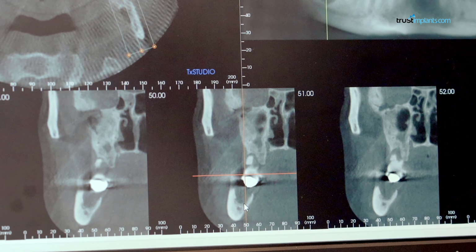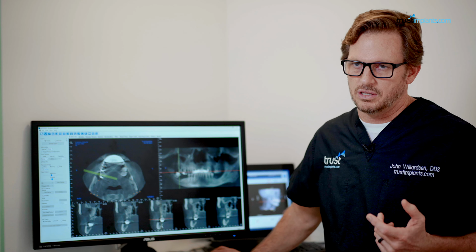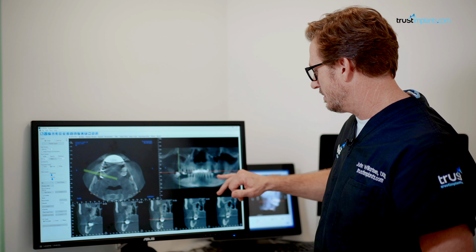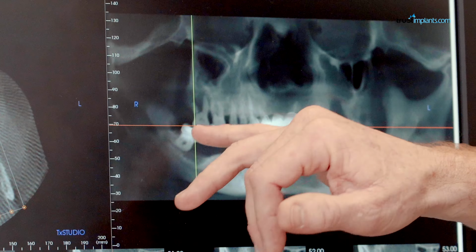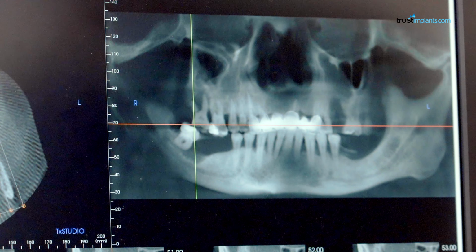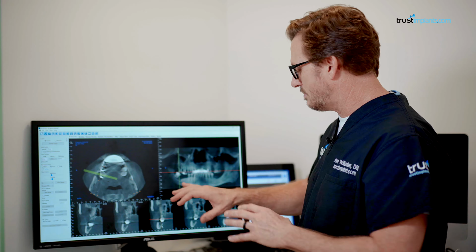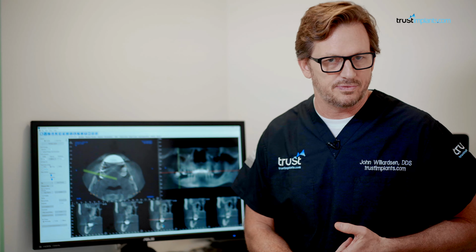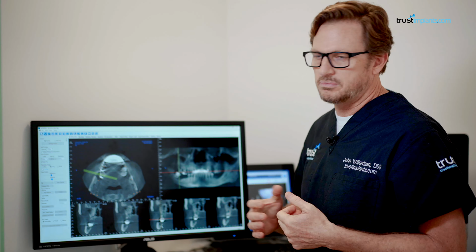And it's struggled for a couple of reasons. One, due to periodontal disease, but also due to overload, because that's the only place he can chew. He has no teeth on this side, on the bottom to chew with, missing some of the molars on the upper. That's really the only spot that he can chew. So it's just getting pounded and overloaded. And so, anyway, in this case, we have to remove all of the remaining teeth due to gum disease, as well as failing dentistry, bridges, failing root canals, and some decay.